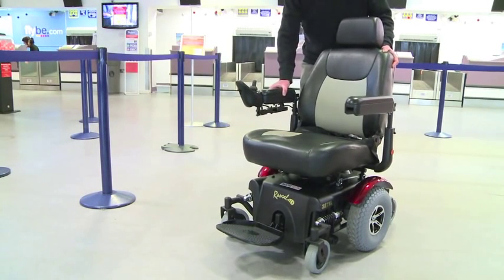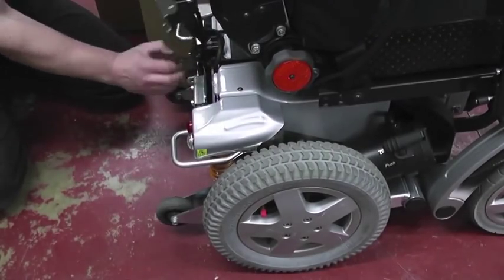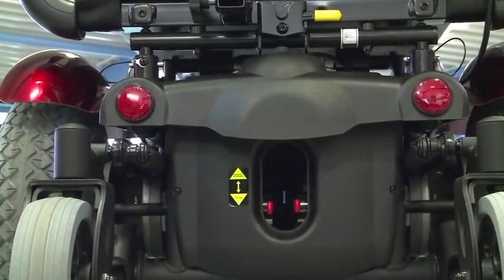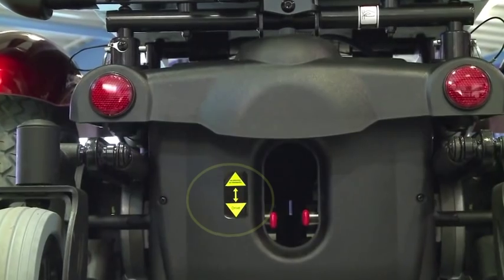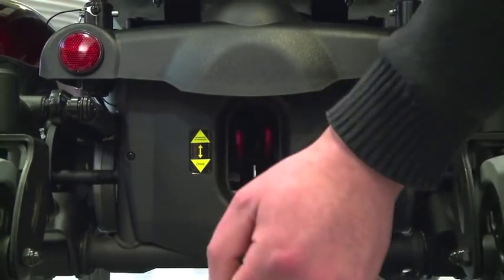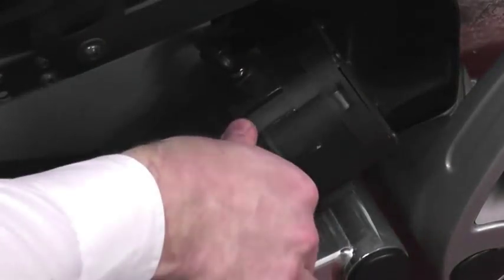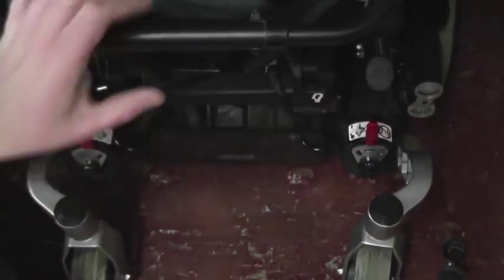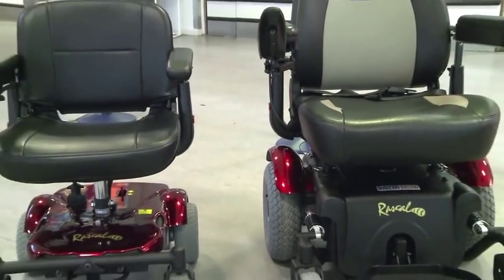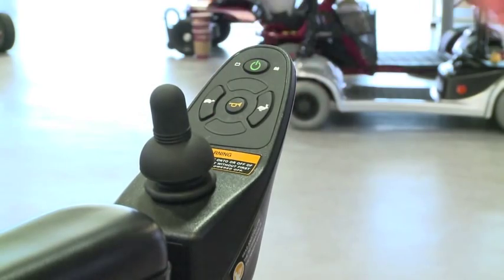It is very difficult to move an electric mobility aid when the drive system is engaged, and this may also damage the motors or braking system. All powered wheelchairs and scooters have a freewheel mechanism allowing the product to be pushed and maneuvered as required — there should be labels showing how this is selected. On a power chair this may be done by pushing levers up, or by rotating a lever; there will be a lever for each drive wheel. The freewheel mechanism should be disengaged after loading and at any other time the device is to be left unattended.